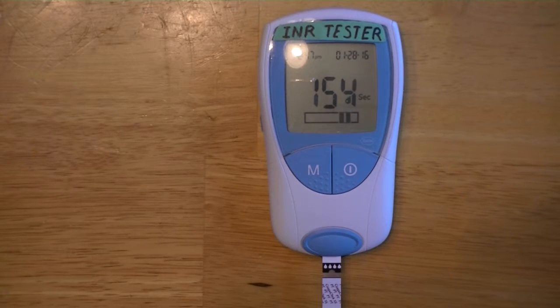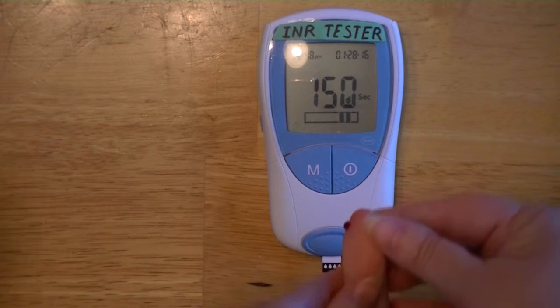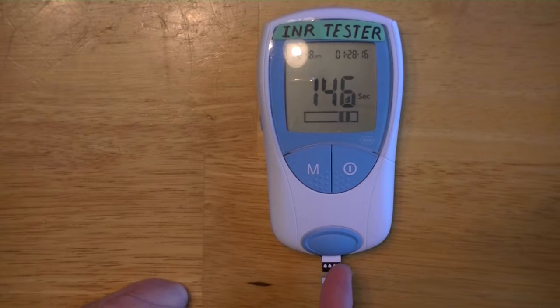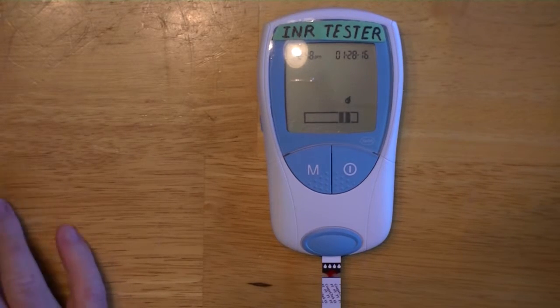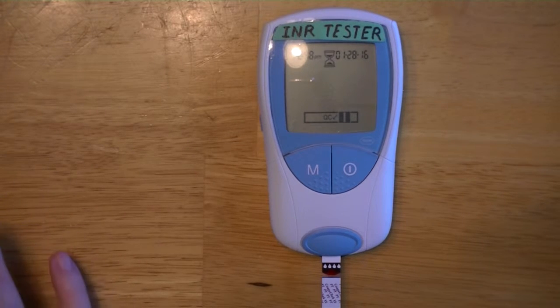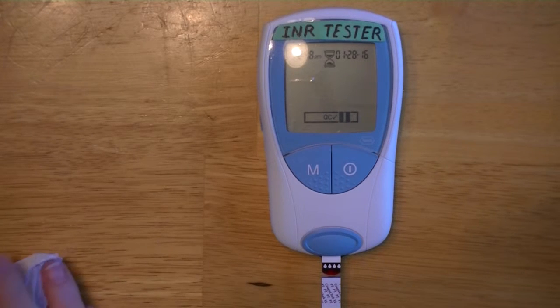As you can see, we got plenty of blood, and then we apply it to the strip. I use a second hand to guide it in, and then it'll beep at me. It should show down here a little check mark saying quality control — QC with a check mark — telling me that it is good and ready to go.